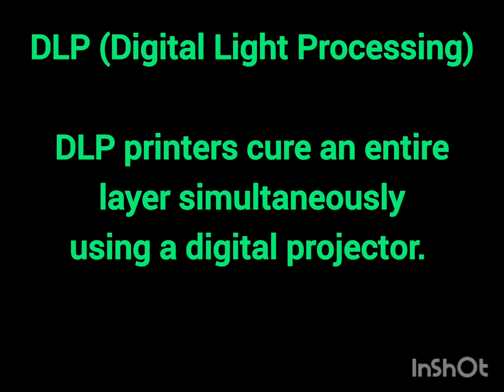Next is the digital light processing printer, that is DLP. DLP printers cure an entire layer simultaneously using a digital projector. This makes them faster than the SLA printers while maintaining excellent accuracy. These printers are commonly used for orthodontic models and surgical guides.